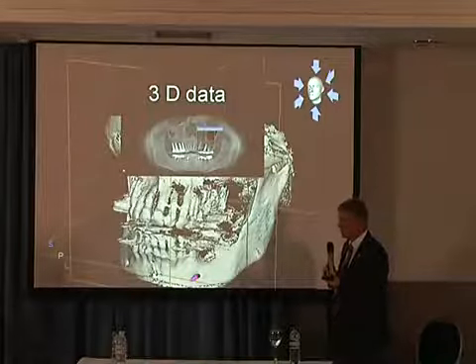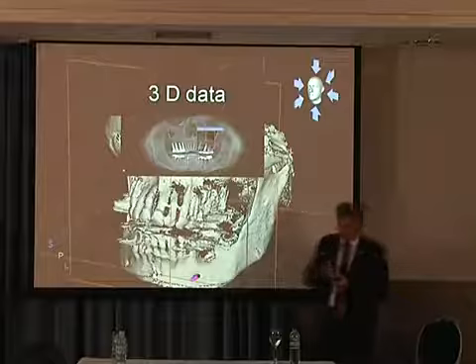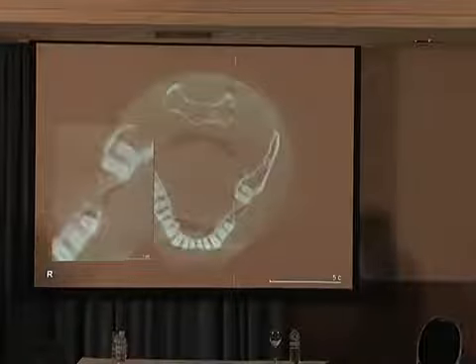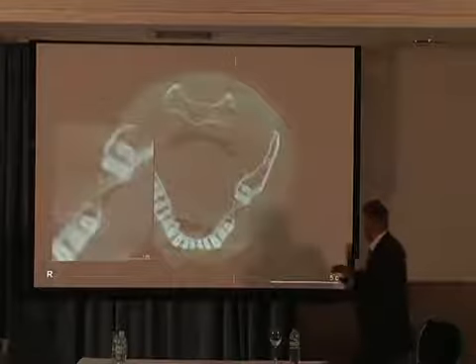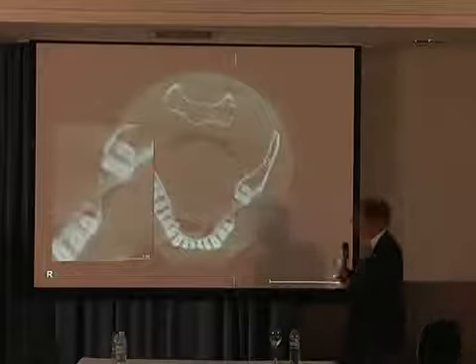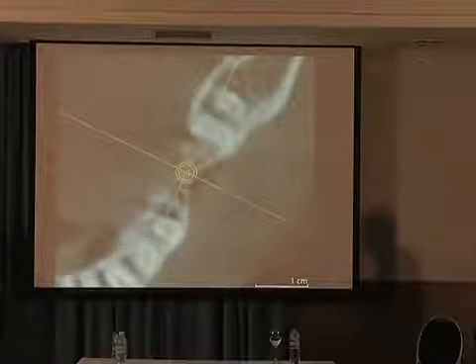1, 2, 3, 4. You get an idea about the 3-dimensional defect here. So this bone is not too much, from lingual resorption from buccal. On the cross-section you see the narrowing of the alveolar ridge. It's hard to place an implant without augmentation.